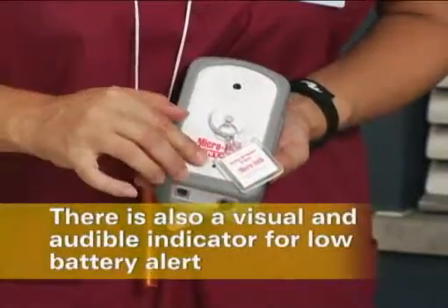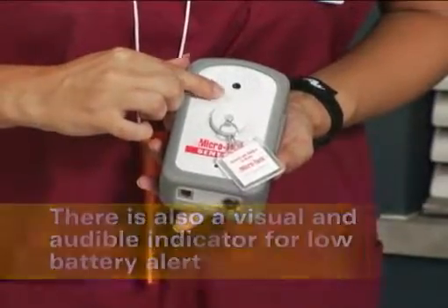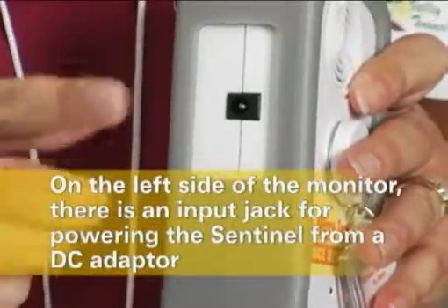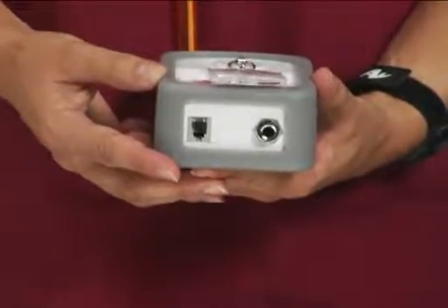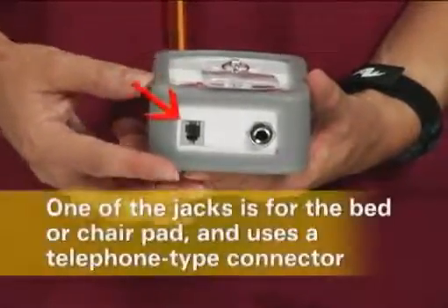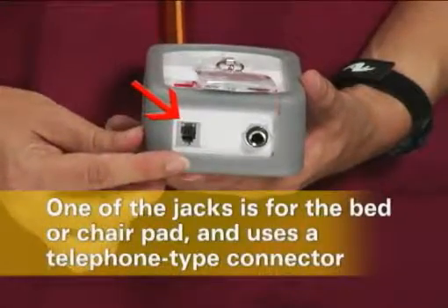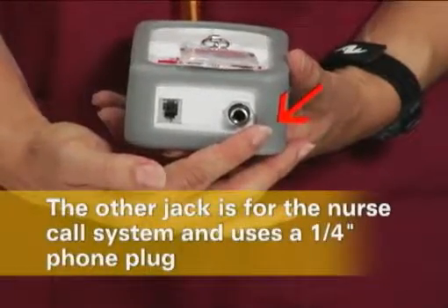There is also a visual and audible indicator for low battery alert. On the left side of the monitor, there is an input jack for powering the Sentinel from a DC adapter. On the bottom of the monitors are two jacks: one is for the bed or wheelchair pad and uses a telephone type connector, and the other is for the nurse call system and uses a quarter inch phone plug.